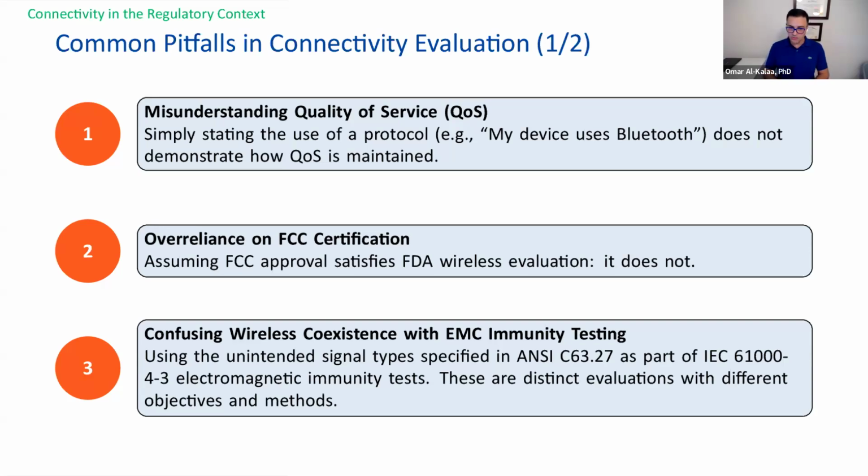There are many medical device manufacturers that consider that FCC certification to be the end of story when it comes to wireless evaluation. It is not. FCC certification meets FCC requirements for market access. It does not meet FDA's concerns about how wireless is being used in your particular device and how it's affecting the safety profile of that device and how the totality of the submission can demonstrate safety and efficacy. So if you're planning on saying, hey, I have FCC certification, that's enough, please don't do that.